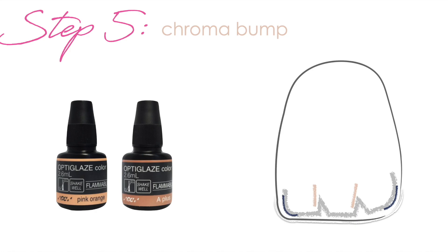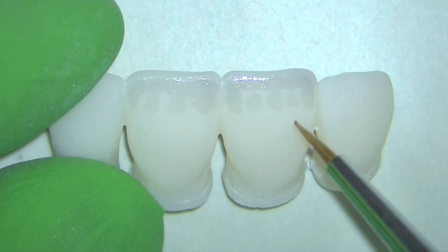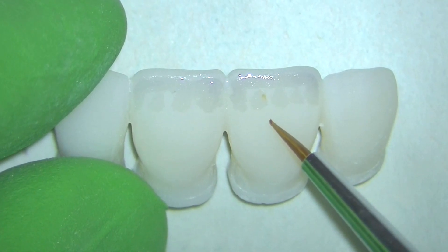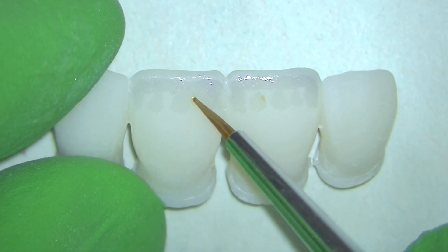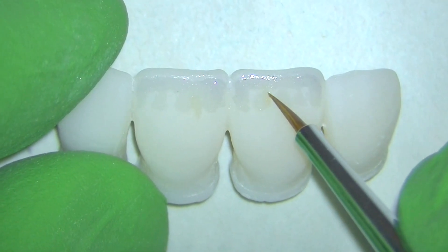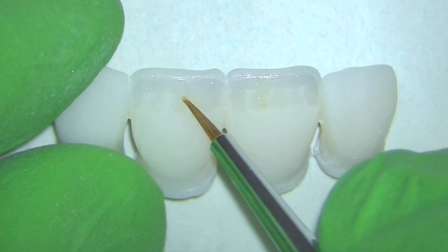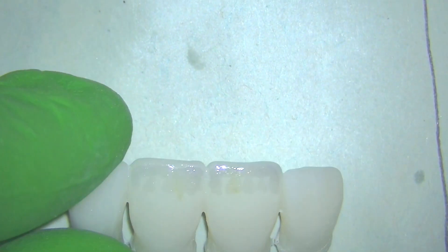Then it's just a little chroma bump in between what would be the mamelons on this, just to accentuate them. If you study teeth, you know that oftentimes there's a little bit of brown — in this case I'm using an orangish-pink color just to accentuate the mamelons. Same technique: add a little bit, clean your brush, and then use that clean brush to diffuse it and make it a little more subtle, and then cure.